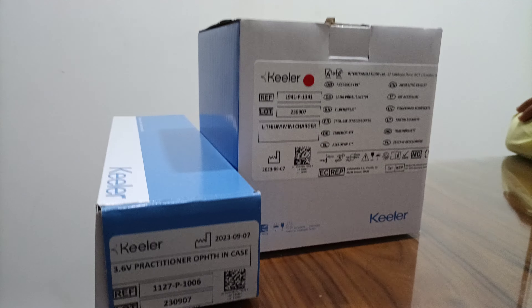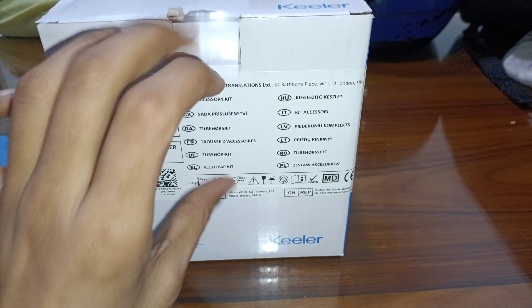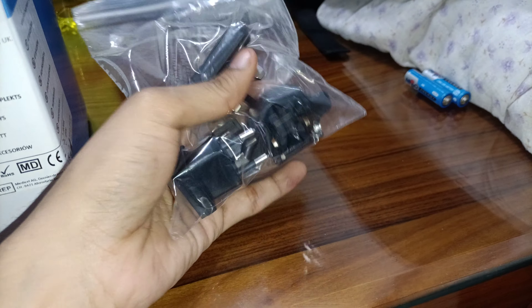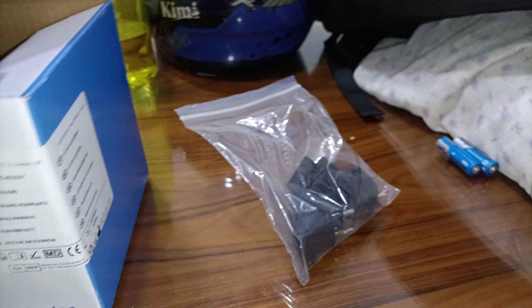3.6 Practitioner Ophthalmoscope, made by Keeler UK. It comes with a mini charger with different ports available, so you can use this charger all over the world.